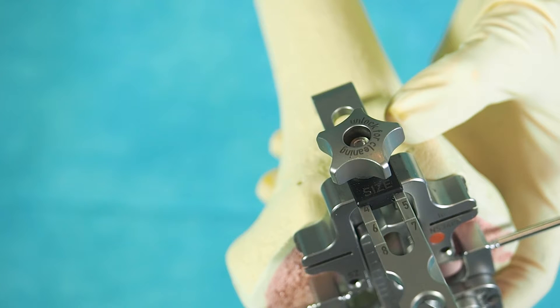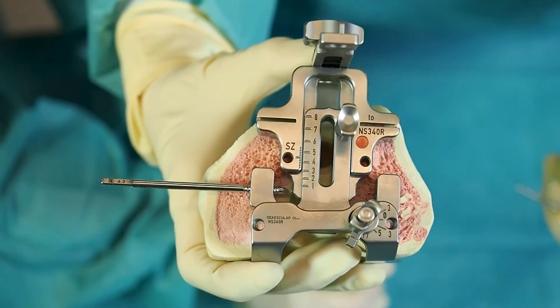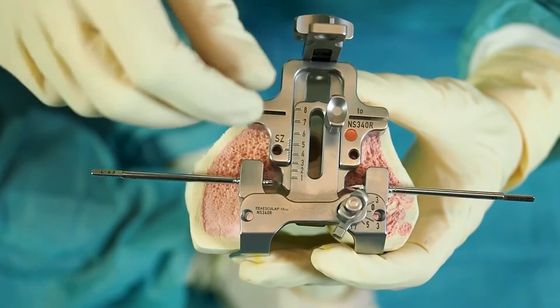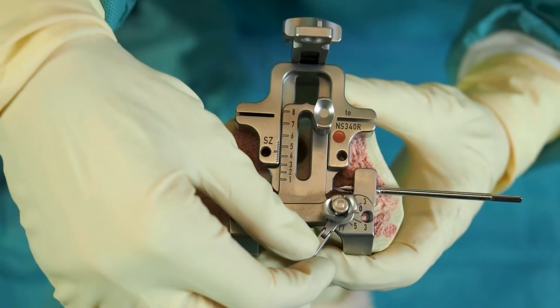By tightening the screw, the stylus position is fixed. The rotational position can be confirmed by using two pins in the sidewise holes of the femur alignment block with reference to the epicondyles. Alternatively, the Whiteside's line can be checked through the slot at the middle of the instrument.